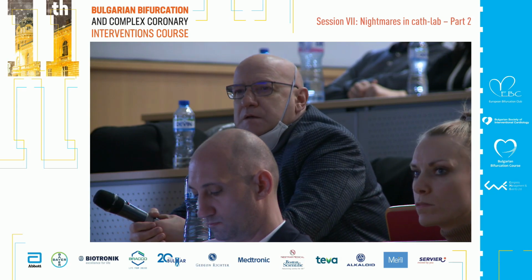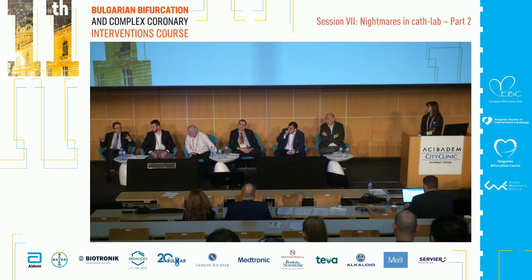First of all, we still have to remember that 75 years old is the recommended age for the TAVI procedure so far. We would love to have it down to 65. There are some hopes that it will come in coming years. We have special situations where even for younger patients we have to do this procedure.